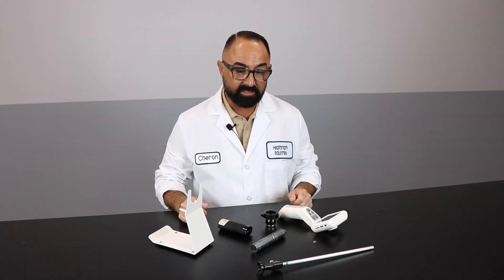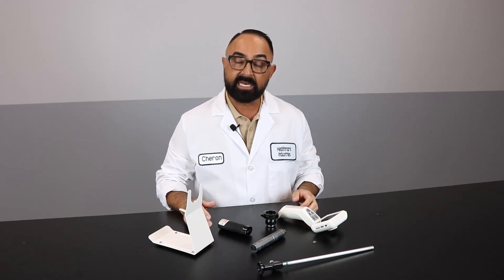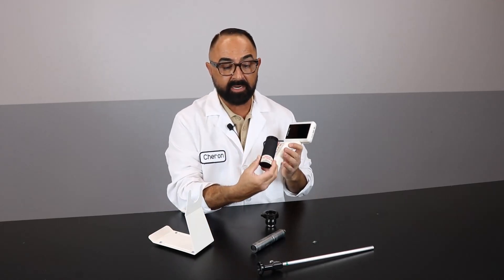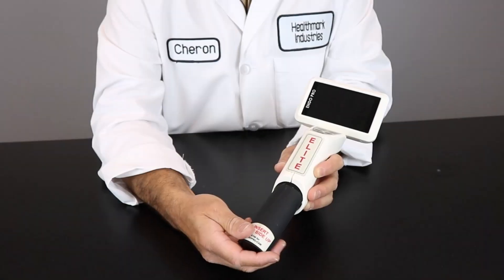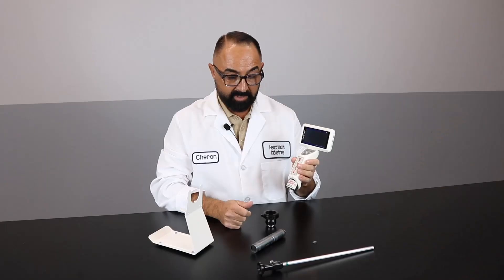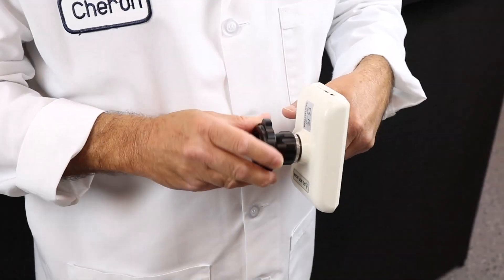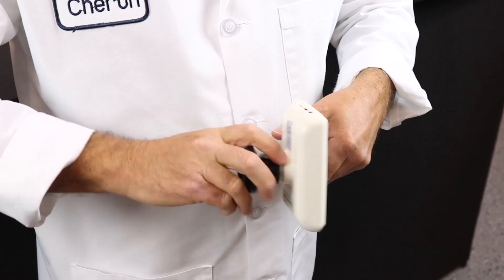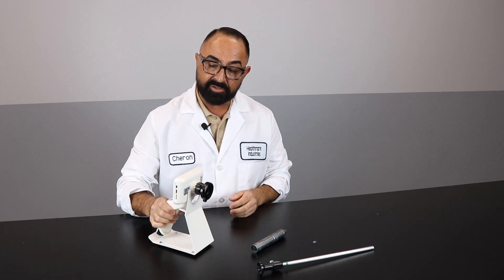Before we go into the details of all the items in your EndoProCam case, let's go over the basic simple steps for setting up a rigid scope. The first thing you're going to do is insert the rechargeable battery. As you can see here, it says insert side up. Simply place it inside your EndoProCam and it starts up automatically. The next step is you're going to insert the coupler into the EndoProCam itself. You simply screw in this piece snug, not tight, and then the next step is you're going to place it on your stand.